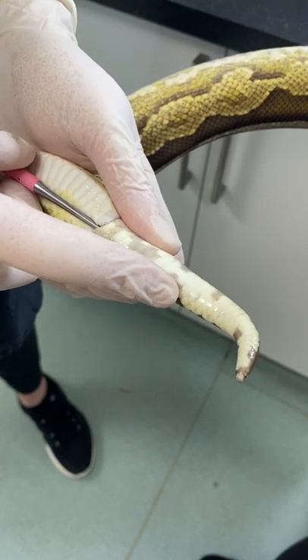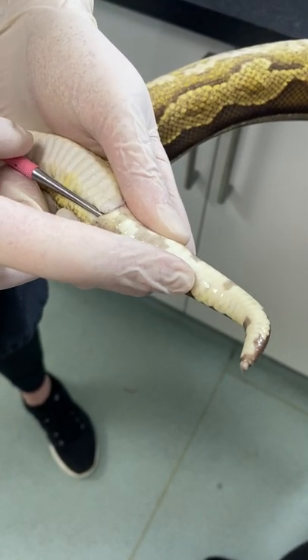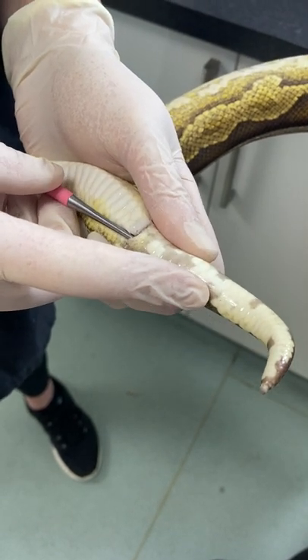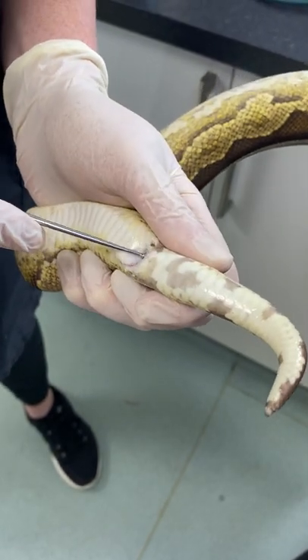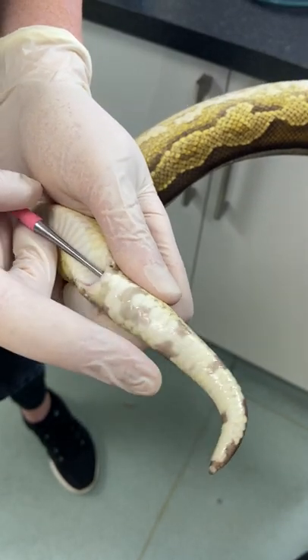Now gently insert the probe and count the number of scales going down. For this snake it's 10 scales — between 9 and 12 you're looking at a male, between 3 and 5 you're looking at a female, and anywhere in between it could be one or the other. You want to pop it in one side and do the same down the other side, just to make sure you're getting roughly the same result.